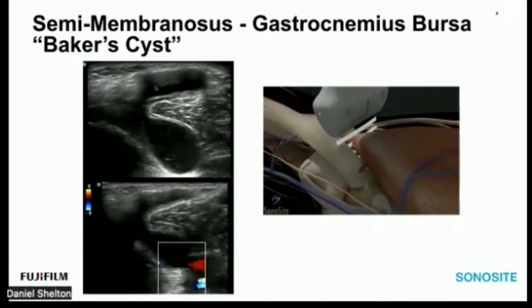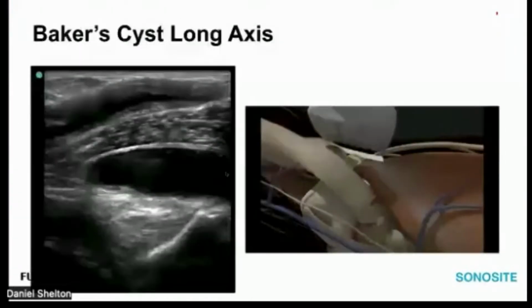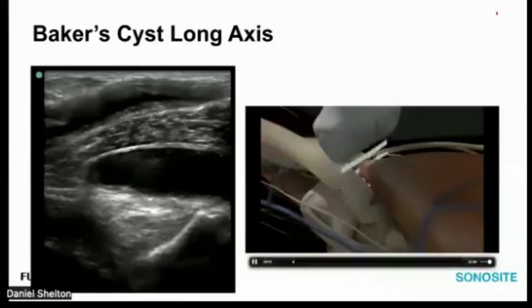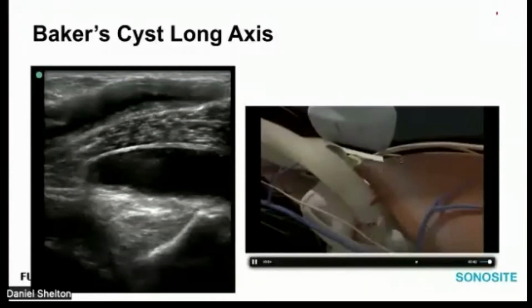It's just if you can't get all of this collection, the long axis is usually a better approach to go chase those loculations. Here's the color anatomy for your future reference. Screen grab that if you're studying these notes later. Here it is in long axis. So we're going to see the animation turn the transducer to long axis. And here's that scissoring effect I was talking about on the anatomy.